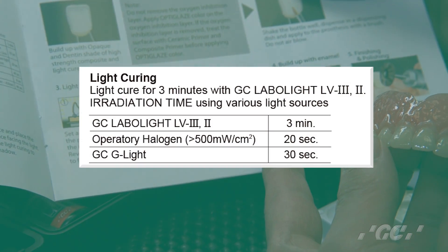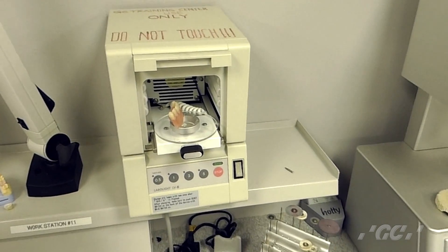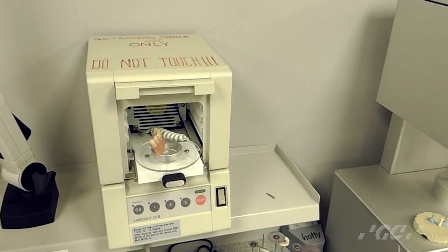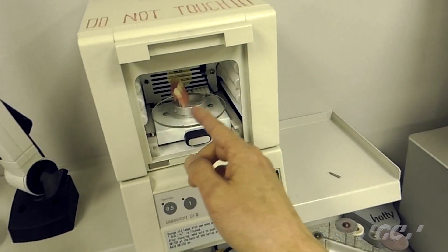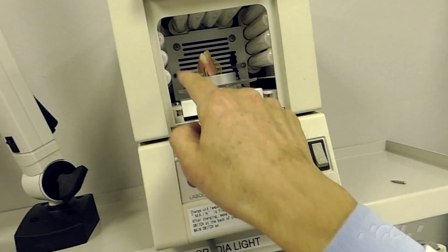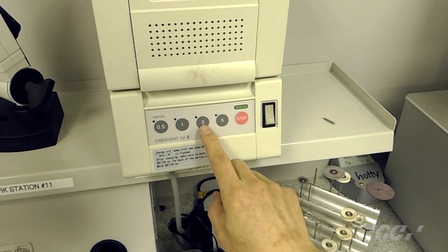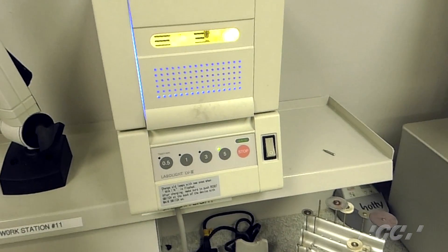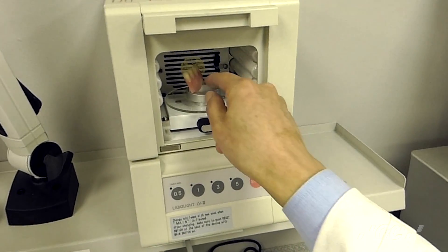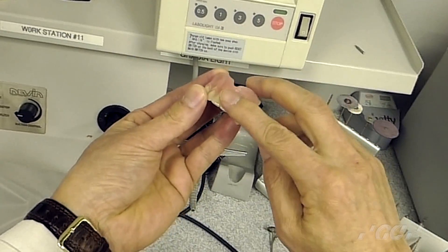Then I will light cure with our GC Labolite. The cure time differs depending on your light source. This unit uses a fluorescent light, so make sure the denture is set up in the middle of the fluorescent light, then close it. Cure for five minutes. After five minutes, take it off — the color is already completely cured and very stable.